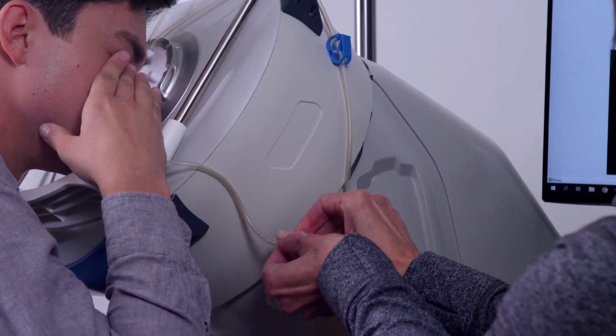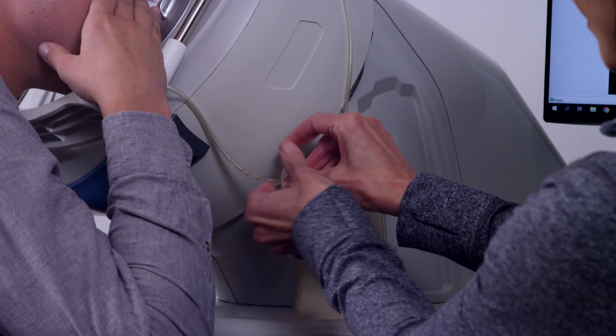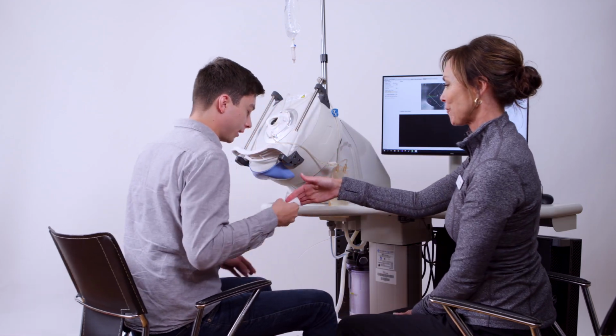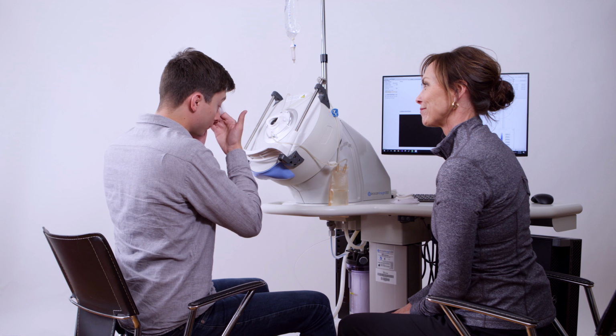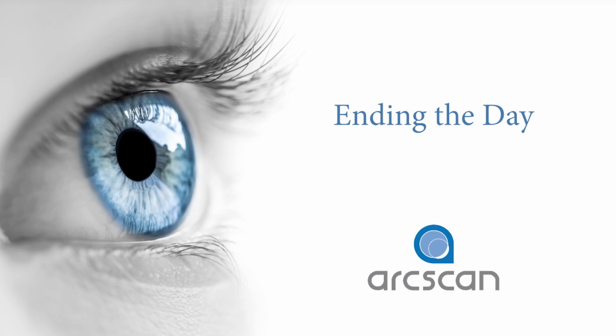When you've completed all the scans on your patient, drain the BSS by opening this clip. Monitor the camera view to see that the saline is draining. Check air bubbles in the drain tube to indicate the EyeSeal is drained. Hand a tissue to the patient. You can use the same EyeSeal for this patient's second eye. When you finish scanning both eyes, lower the distilled water to half so that you can remove the EyeSeal.